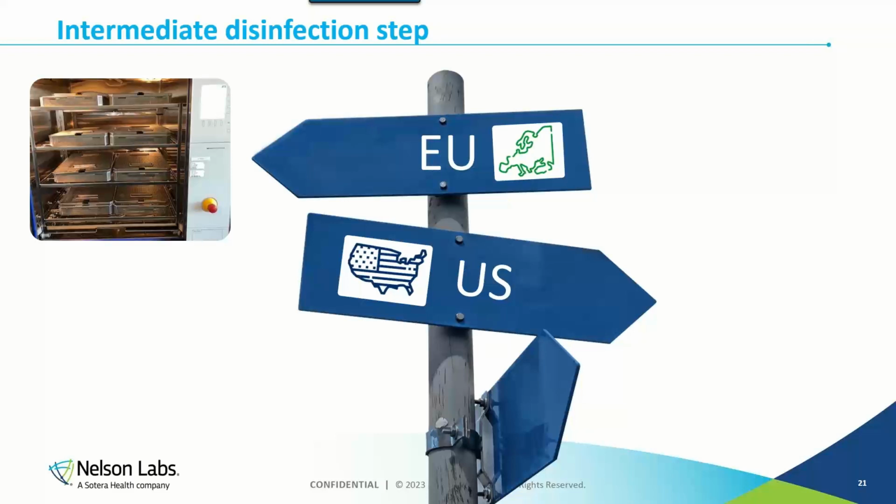For the US, this is not really strictly necessary. So you can just have cleaning and sterilization. There's no real need to include this intermediate disinfection step. It is something that is recommended in the guidelines as well, but they will not strictly enforce this.